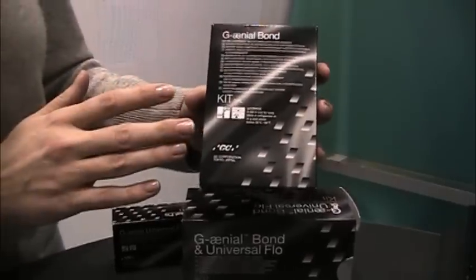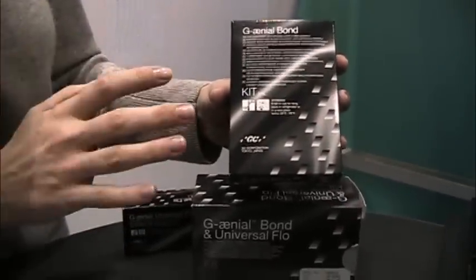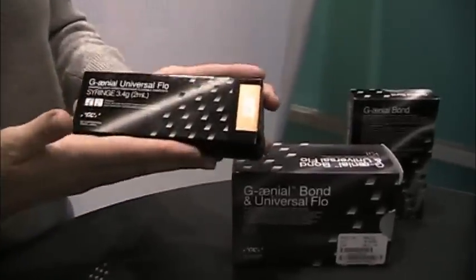This also has increased bond strength to both enamel and dentin. It's going to be fantastic, very easy to use — 30 seconds start to finish and you're ready to go. A great new bonding agent, and we're really excited also about our new flowable composite.